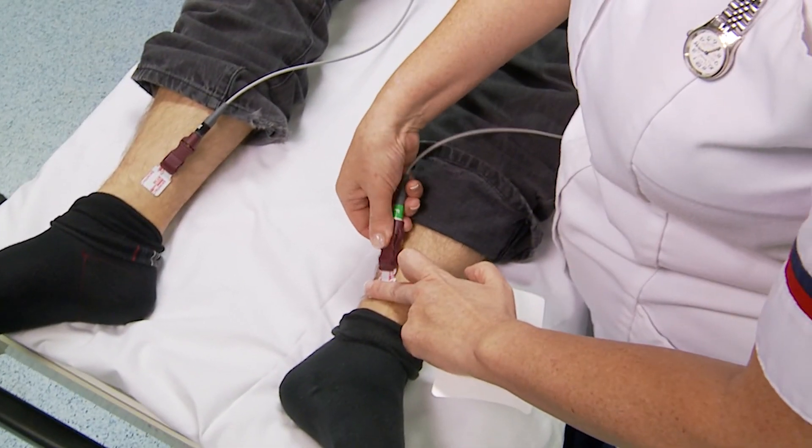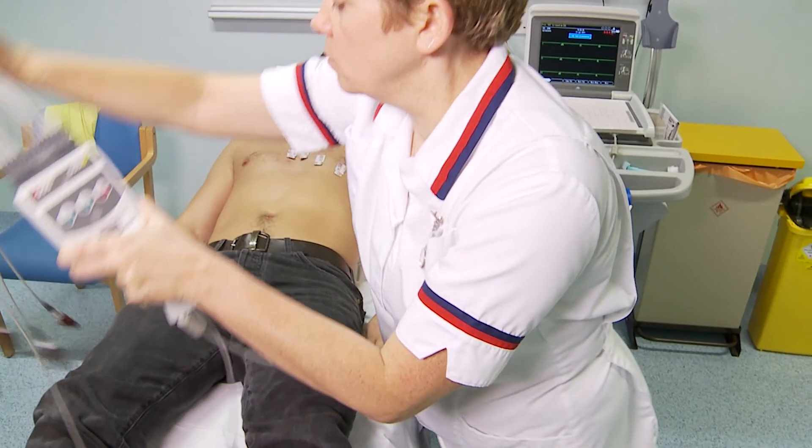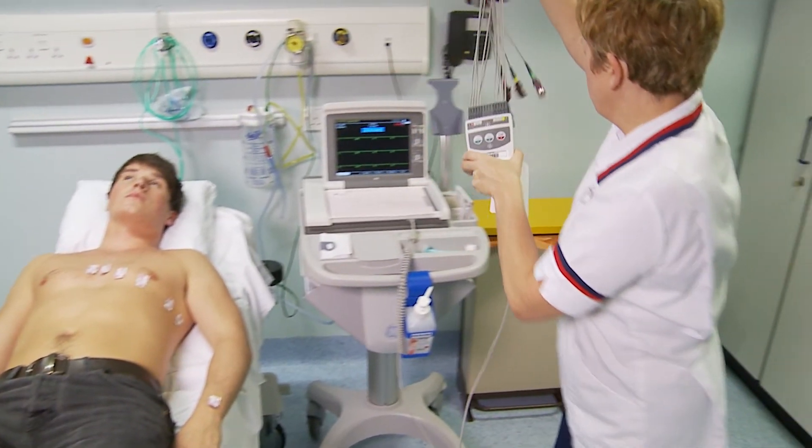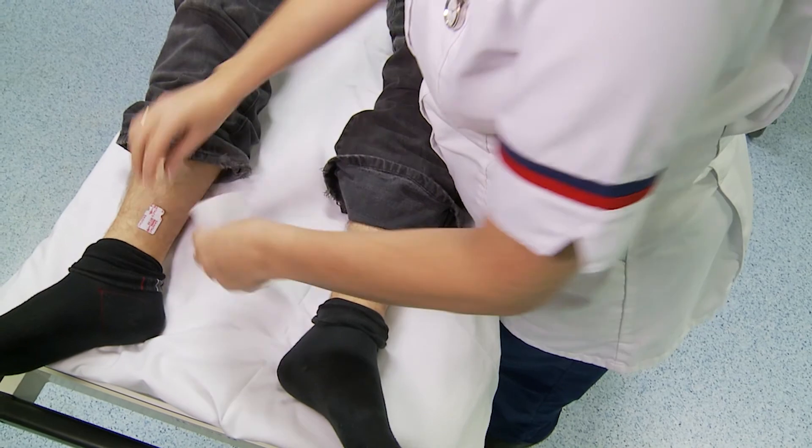Now the procedure is complete, allow the patient to redress. Clean and clear away equipment, storing it appropriately. Remove your gloves and apron if worn and clean your hands.